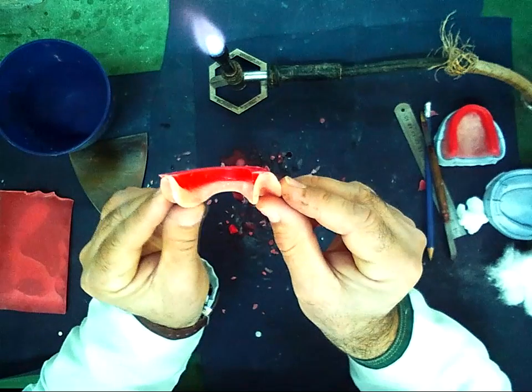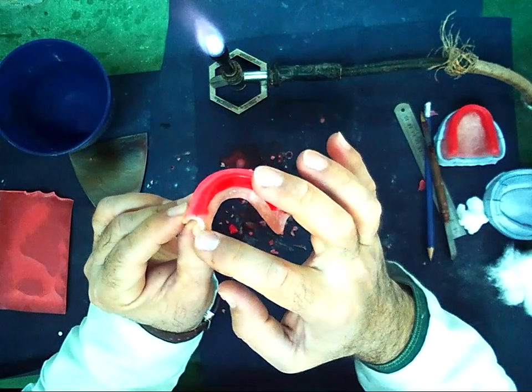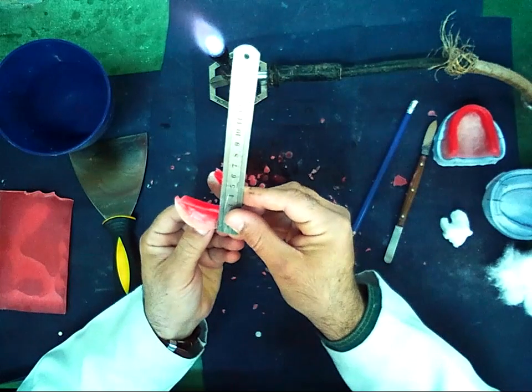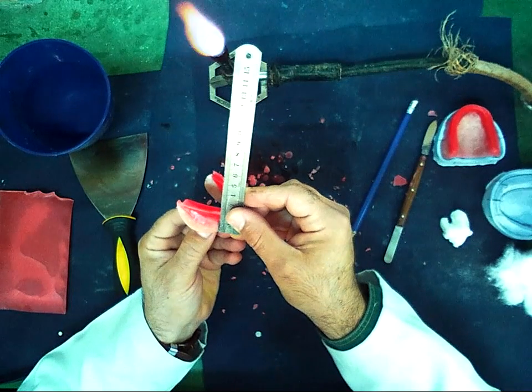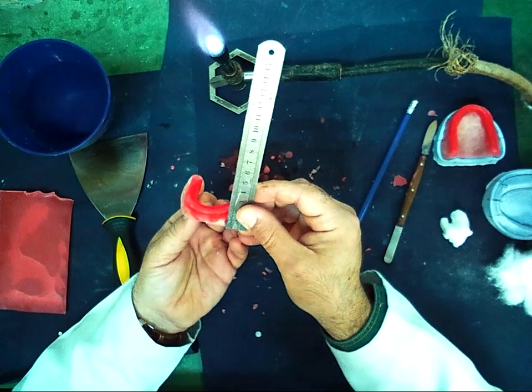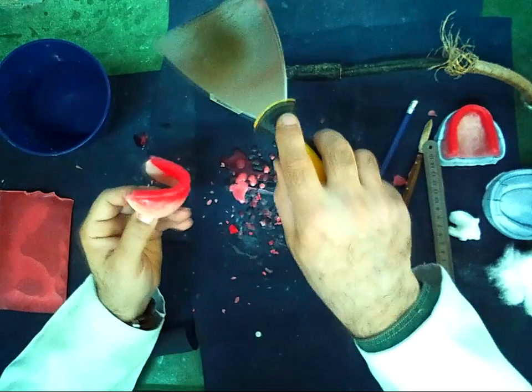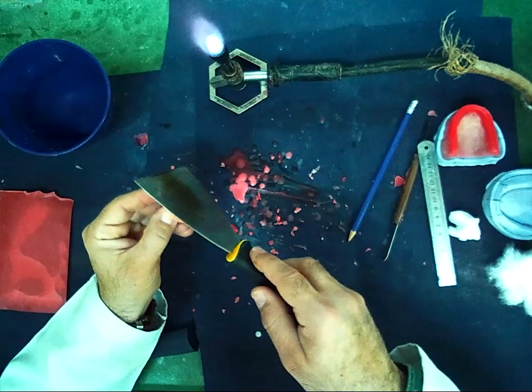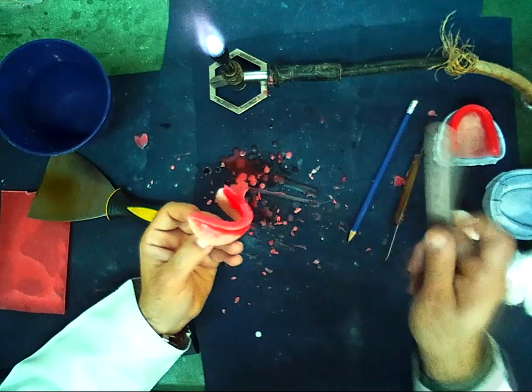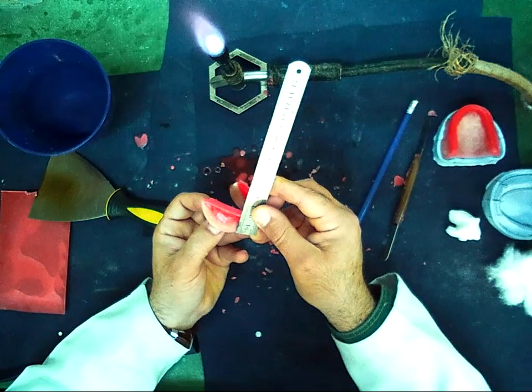Posteriorly it becomes 0. The level of the wax is exactly with the level of the record base. And on the anterior part, it is 19, and in this side it's 18. So I should take 1 mm from this side. Become 18.